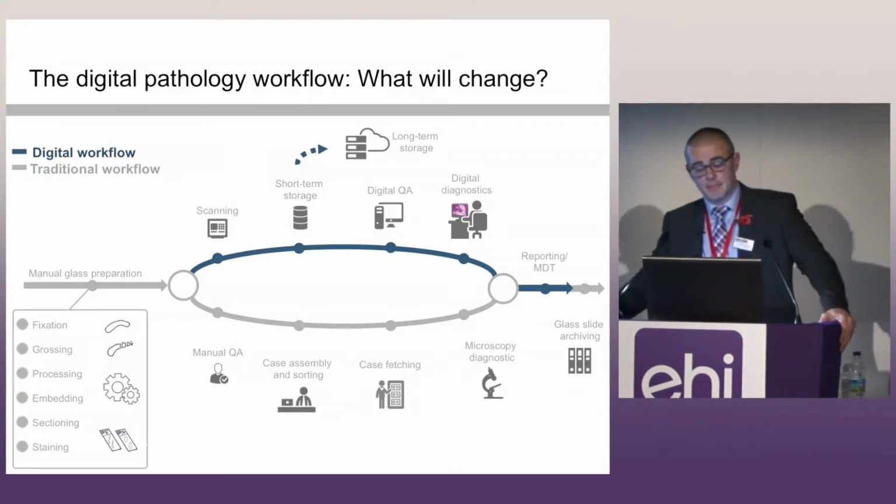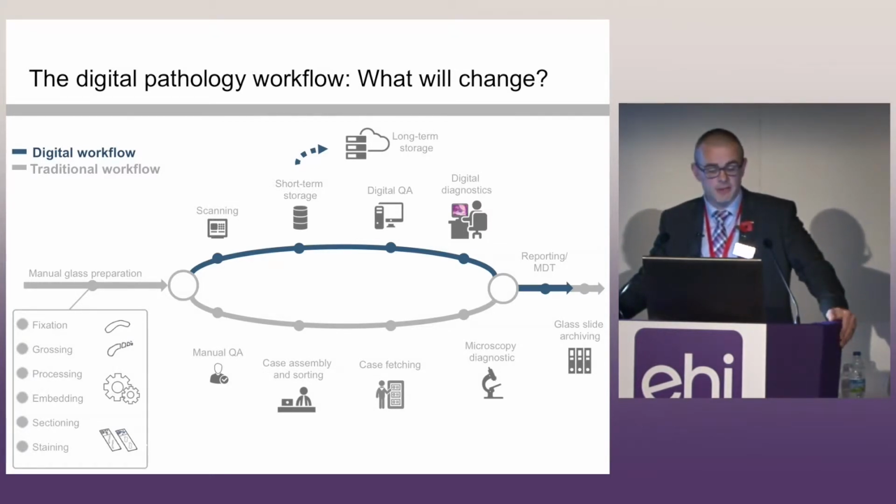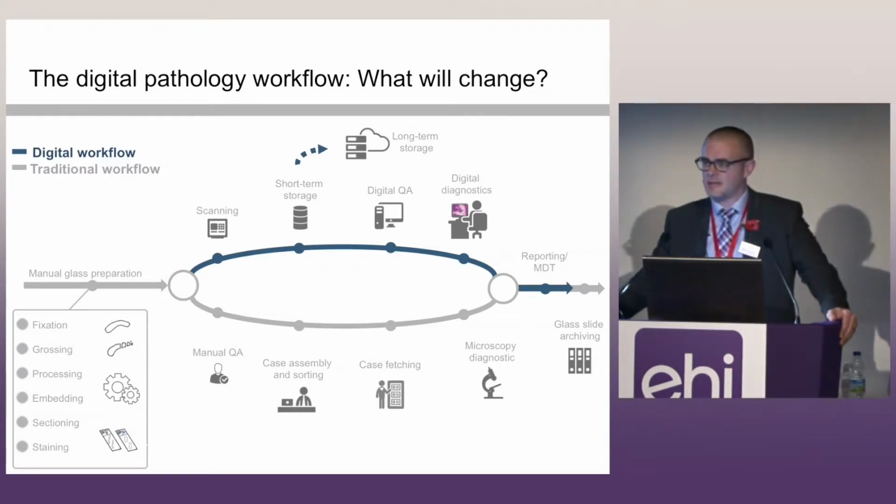Should that examination warrant further discussion, maybe at an MDT for oncology review, those glass slides are retrieved, taken to the MDT meeting, and hopefully presented alongside the radiology imaging, blood results, etc.